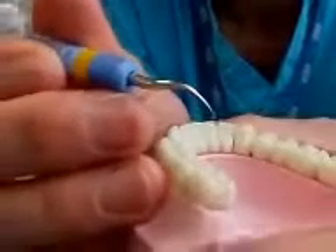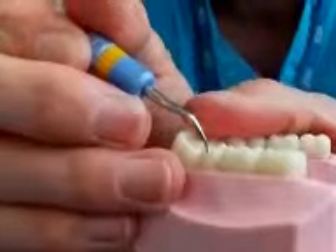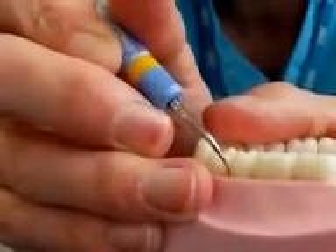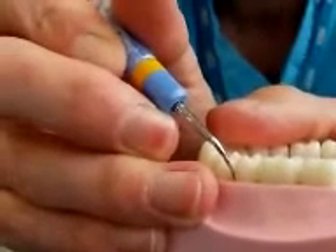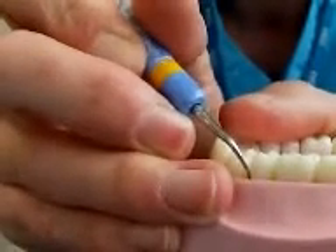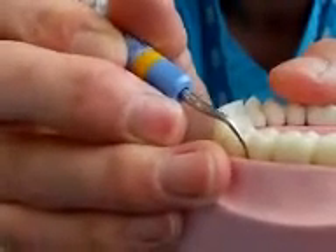So when you're using your tip, what you need to start getting really used to is feeling the crevice, or the base of the pocket. This is when you're doing subgingival scaling — cleaning the base of the pocket — and getting used to that slightly spongy feel.